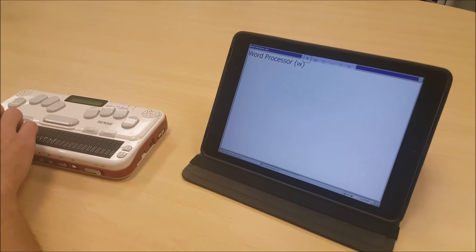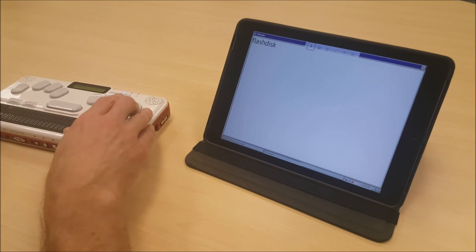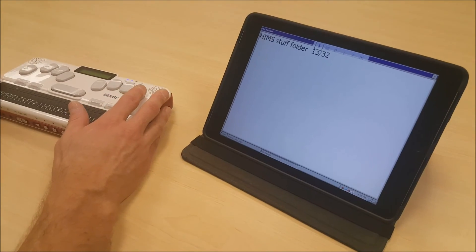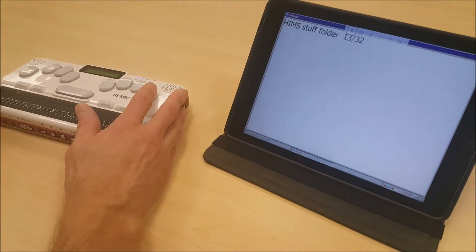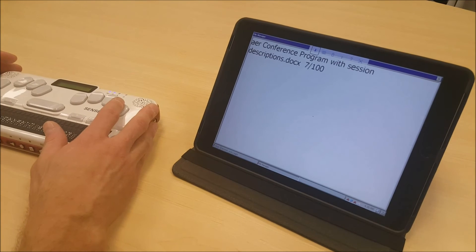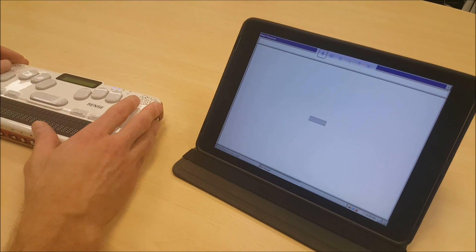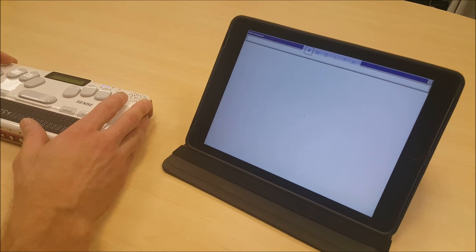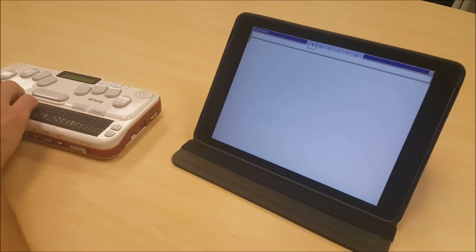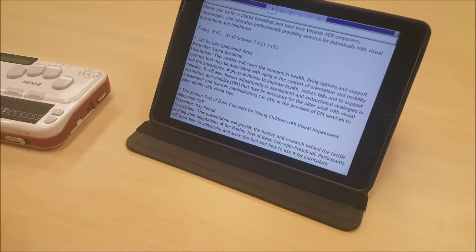I'm going to go up to File Manager and choose the Flash Disk by pressing Enter. I'm going to press Enter on the HIMS stuff folder, and we're going to open an AER program — the AER conference program with session descriptions. And I press Enter to open it. Here's the AER conference program from Virginia AER.